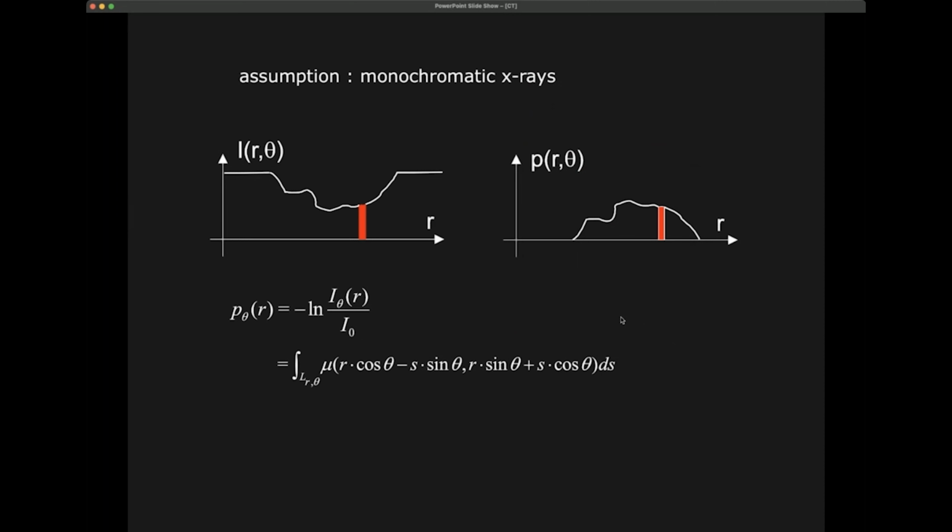As we said before, we convert this with the logarithmic transformation. What you can now prove is that, because this is the logarithm, we can rewrite what we are measuring as this function of the attenuation coefficient at the points r alongside the line, and the angles, with a sine wave.